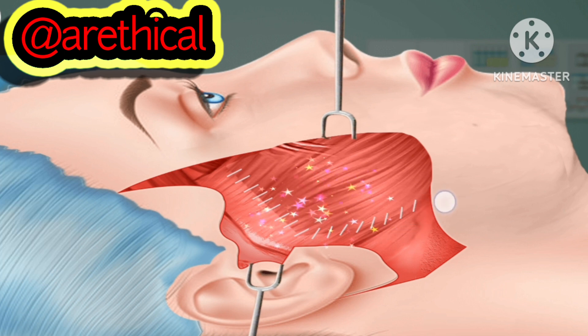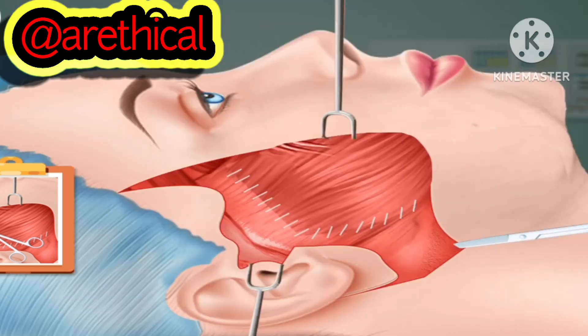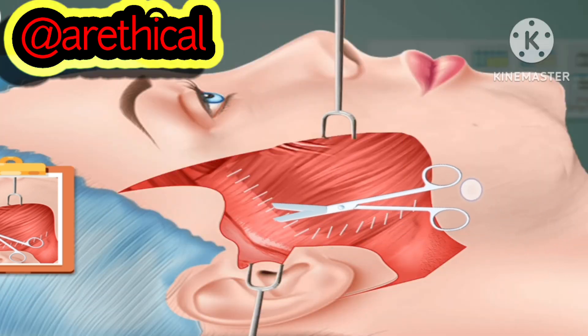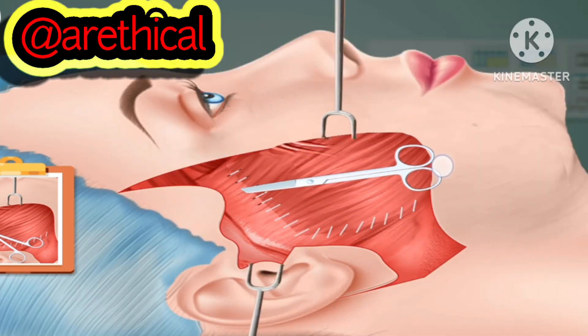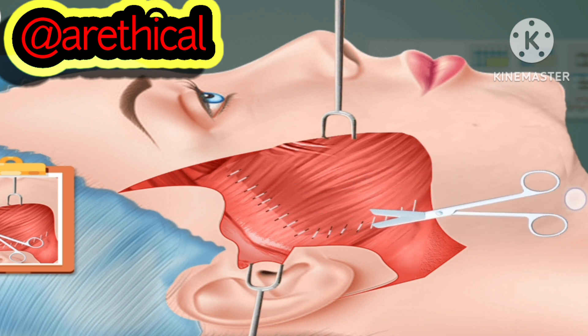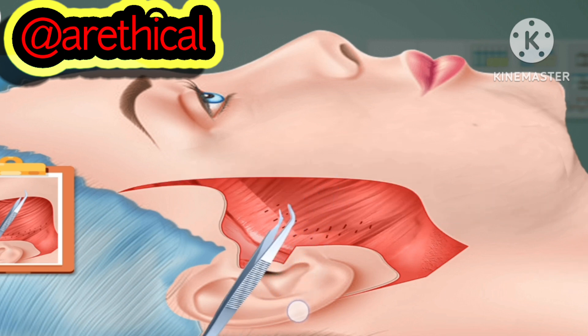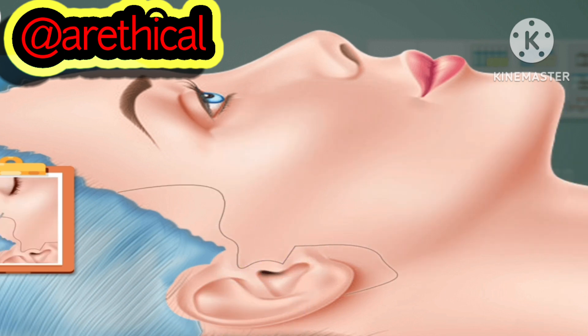Lift the flap to tighten the face. Sometimes later, remove sutures, put the skin back, suture it.